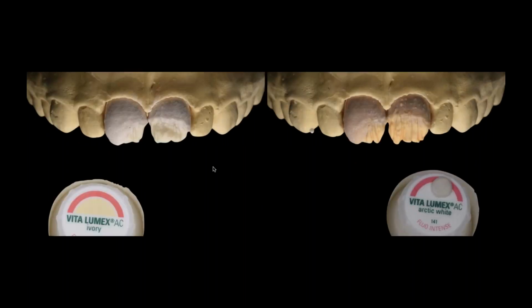But here's kind of the beauty. So I told you on the first case, I used my effect chromo or opacious dentin in essence for you guys who don't use VITA products. But I had to mix in some fluorescence, right? I took a fluorescent staining powder and actually mixed that in because I wanted that little bit of extra fluorescence.